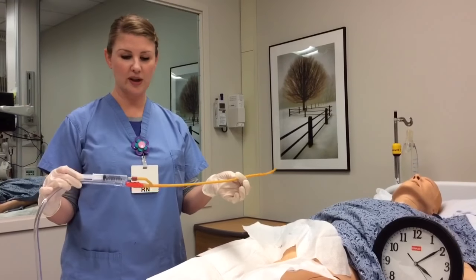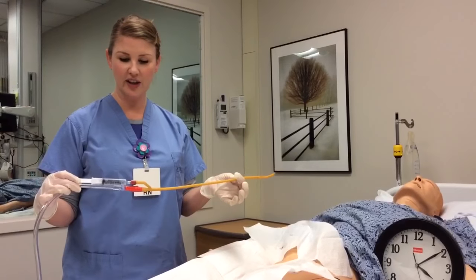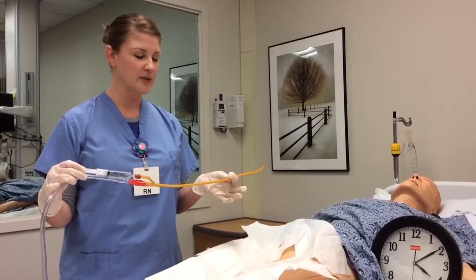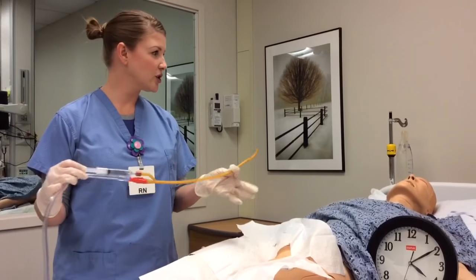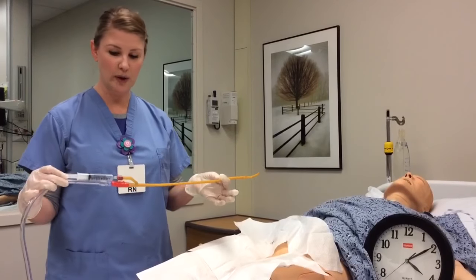This video is to show the proper technique of inserting a CUDE urinary catheter. This video is not to show sterile technique. We're going to assume that our patient has been prepped with aseptic technique using sterile equipment.